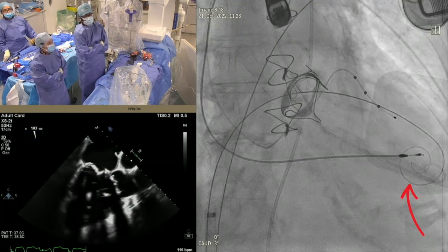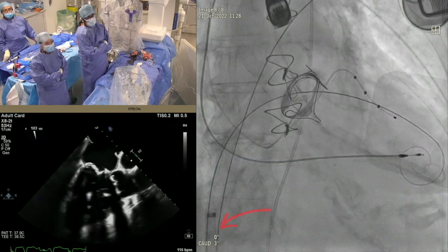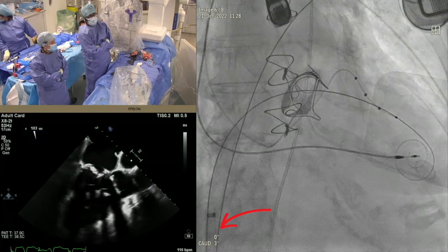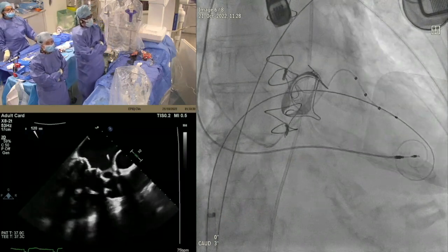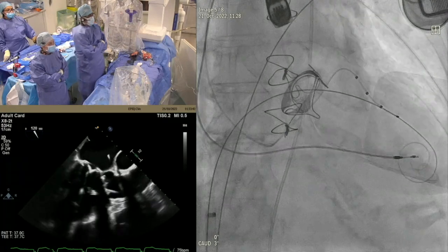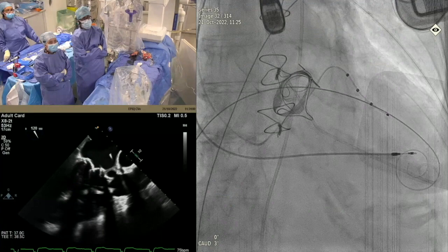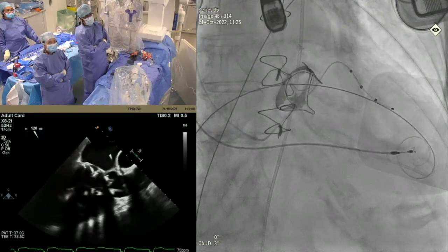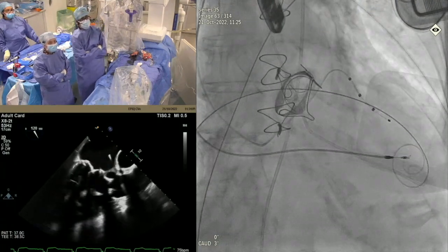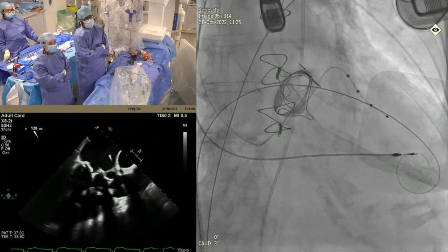And we've now got a Safari wire, and you can see that I've changed the sheath to the E sheath. So where we're now at is that we have a Safari wire, which is through the mitral valve with an E sheath in the IVC. We'll see the E sheath coming up. And actually, I've taken the dilator of the E sheath through to see how something reasonably stiff would traverse the septum and the mitral valve.